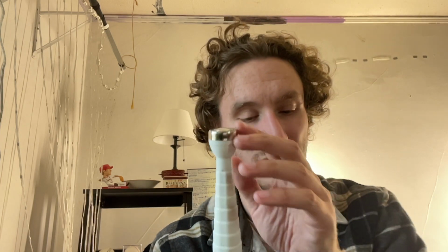So, what does that mean for this cane? Is it useless because I can't have it outside? It depends what you specifically are doing. My first impressions, as you saw in those clips, were that it probably is suited best if you have a more predictable or indoor routine where this rolling tip can really help you out a lot in tiled and carpeted surfaces, fairly predictable travel routines, maybe in and out of the train, up and down the stairs to work, that sort of thing.